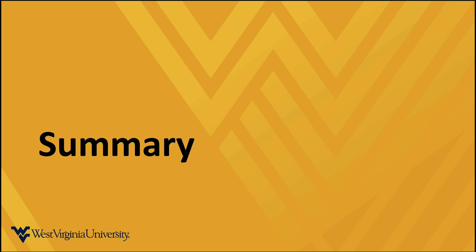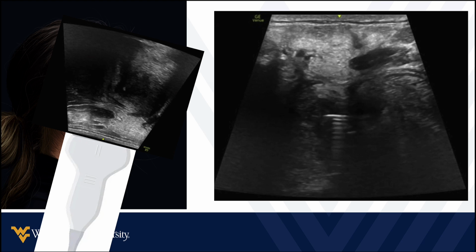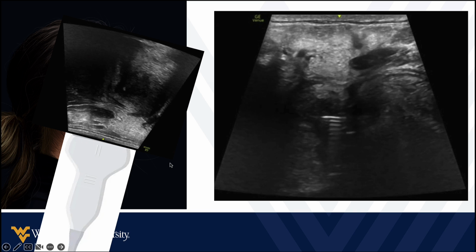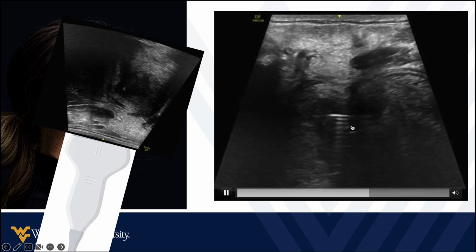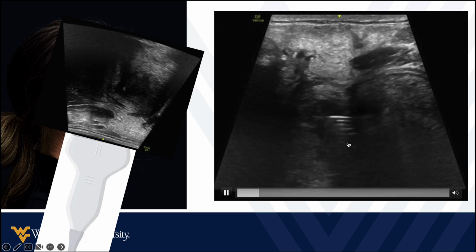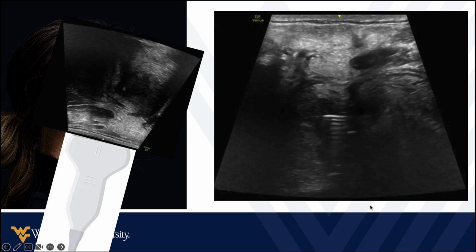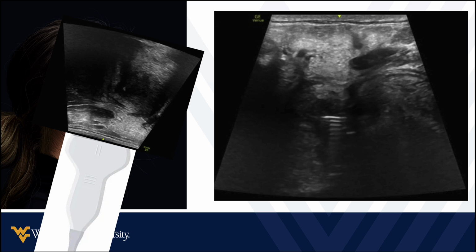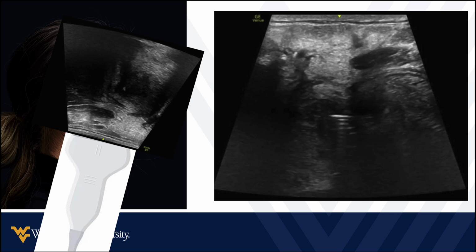So just in summary, mainly talking about the submandibular approach to diagnosing and helping guide ultrasound-guided drainage of peritonsillar abscess. So stick the probe under the mandible. Remember, your up-down is a little disorienting, and then you can guide the needle in. Here we can see the needle getting into this abscess and draining it, and you can avoid CT scans in these people, make them feel a lot better, decrease resources, time, consults, follow-up, and things like that.